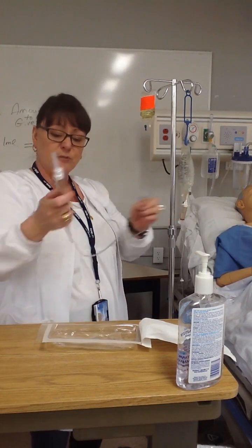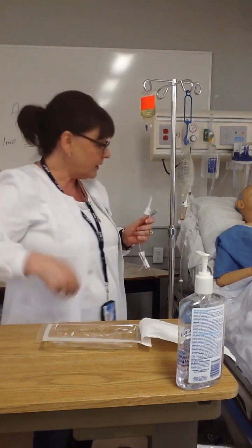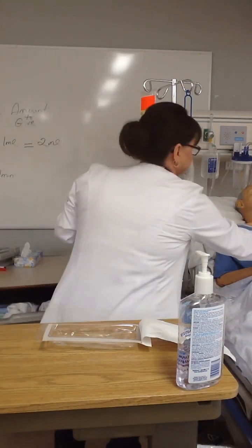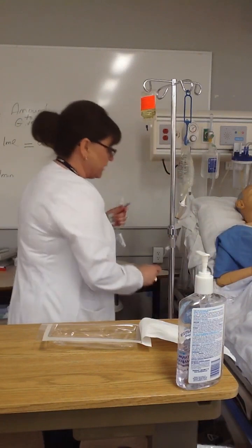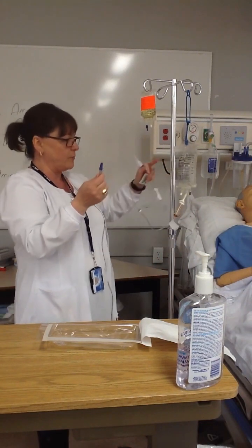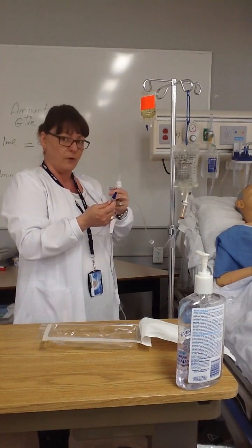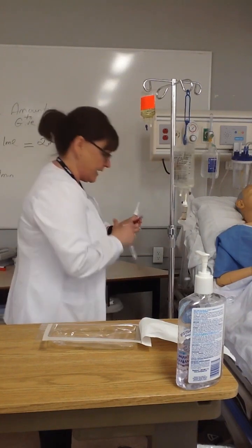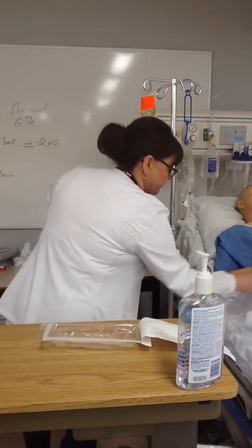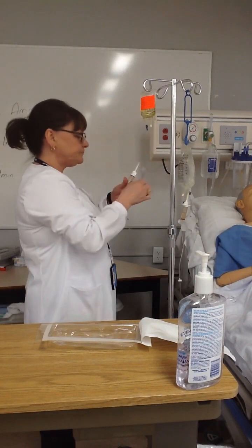I have my new tubing with the roller clamp closed. I have a sterile end, and I have an alcohol swab right here because I'm going to be connecting that end in a second to this first Y port closest to the top of my primary set. And that needs to be swabbed really well to remove any microbes. We're going to do that in a second. But first we're going to spike this little bag and prime it.